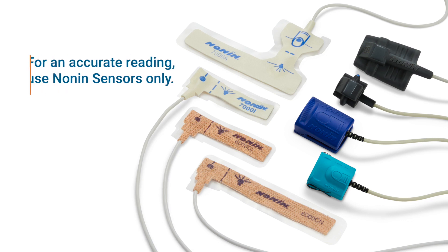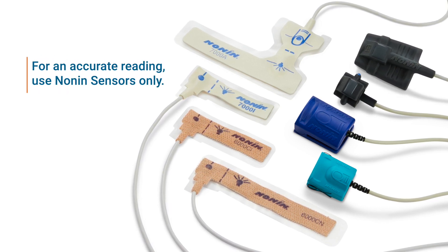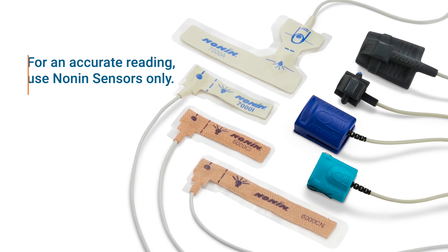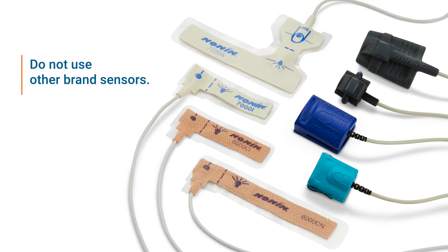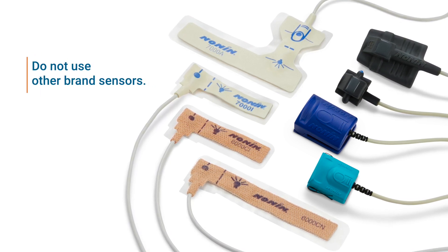The NANAN model 7500 pulse oximeter measures oxygen saturation and pulse rate and is compatible with the full line of pure light sensors from NANAN Medical. To ensure an accurate reading, NANAN brand sensors must be used with the pulse oximeter.